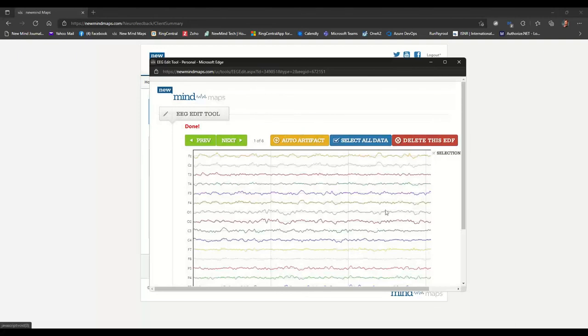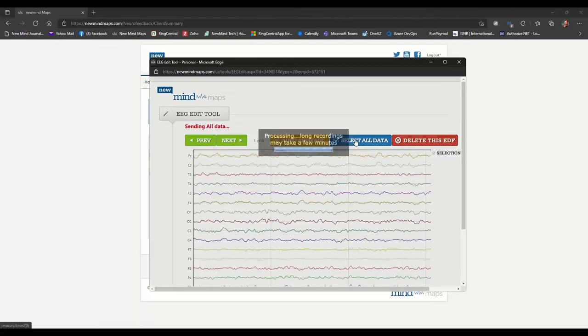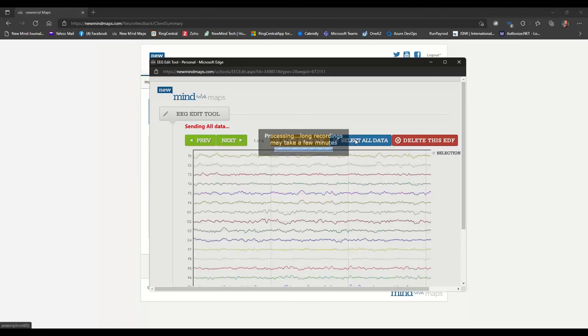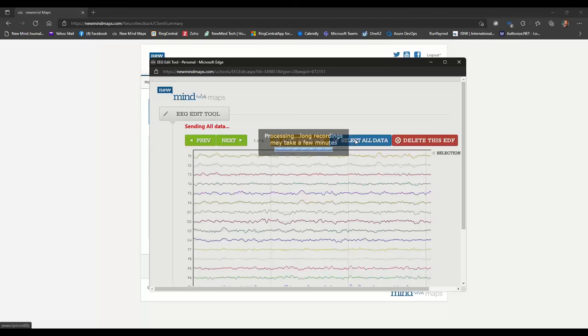And then because I know that all this data should have all the artifact removed, I'm just going to click select all data. And depending on how long your recording was will determine how long this process is going to take. If you did a standard one or two minutes, it shouldn't take too long. But if you chose maybe a five minute recording per location, you can expect it to take a little bit longer. So we'll just patiently wait for this information to be processed. And then we can continue on with the eyes open. And then we'll be done.